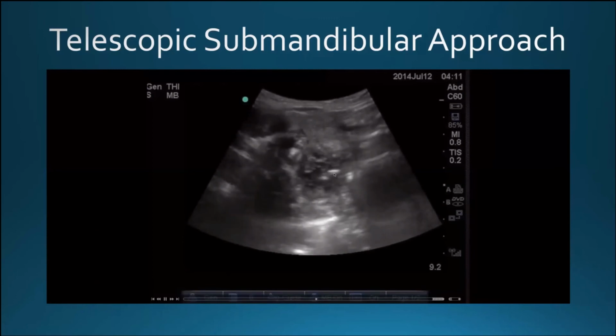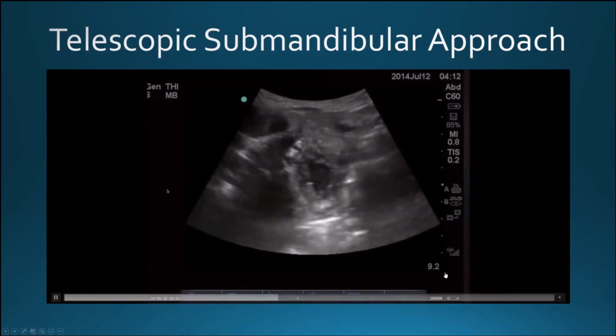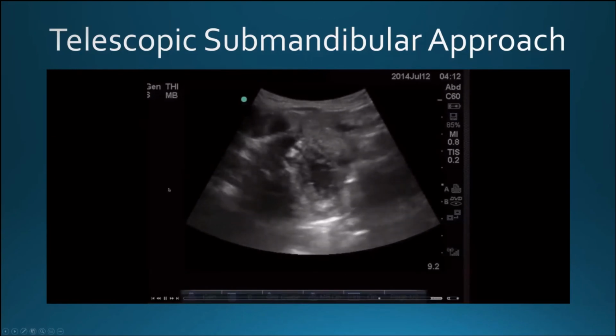And again, you're seeing this in live, so you're able to identify where the needle is. You can see the vascular structures. And so the lidocaine is in. He used probably a 25, 27 gauge needle, pulled out, and put on a larger gauge needle, most likely an 18 gauge, because you never know just how viscous the material inside the abscess can be.